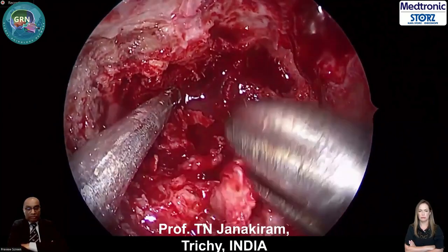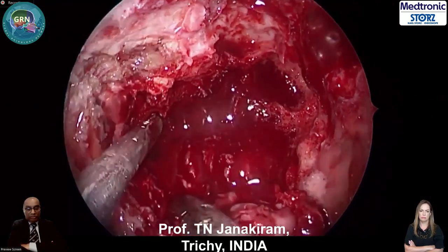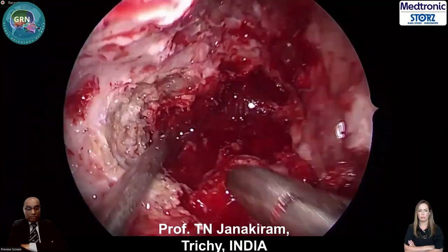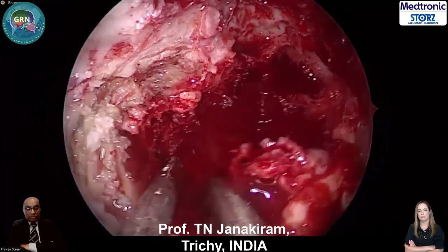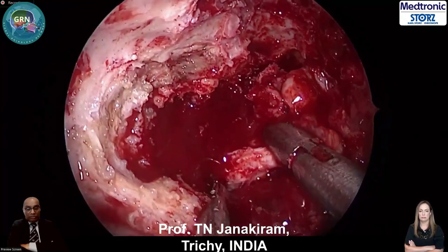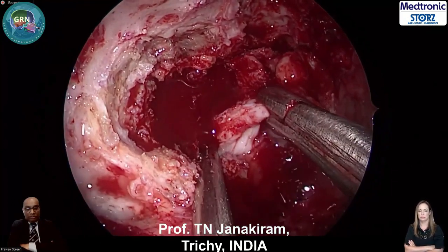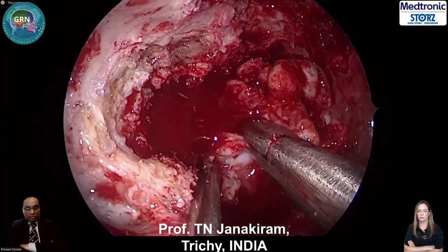Give irrigation. Keep irrigating. Irrigation. So the only way to control this bleeding is irrigation. Please understand, the best way to control this bleeding is irrigation, nothing else. Just irrigate, irrigate, irrigate, irrigate. Because venous bleeding, the best way is irrigation.